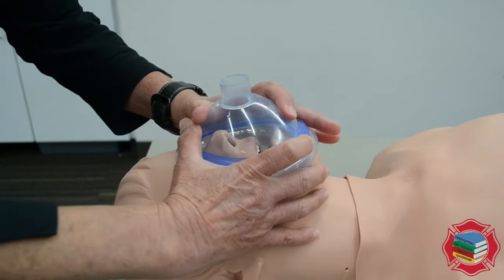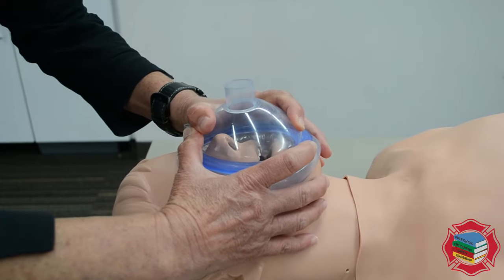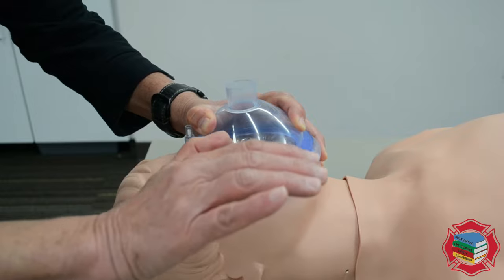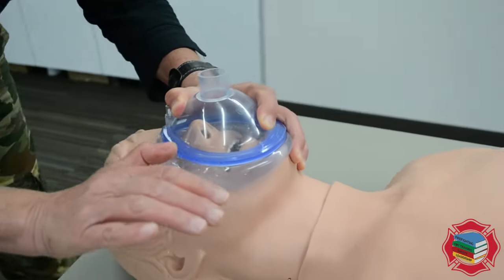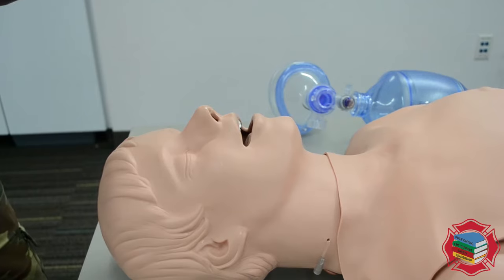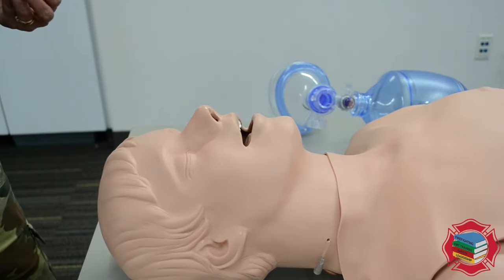If you're just gonna hold it on with one hand, you would generally hold the mask on with your non-dominant hand, and then your dominant hand would be free to squeeze the bag. Now we're gonna actually open the airway, support it with an oral pharyngeal airway, and then provide positive pressure ventilations.